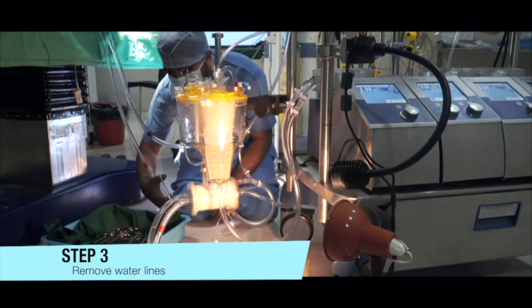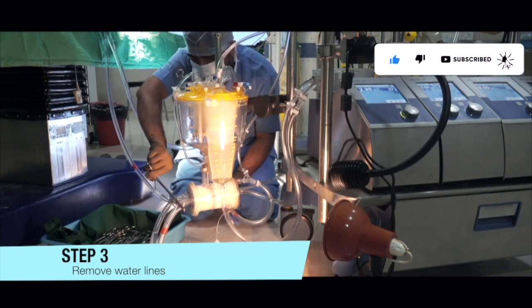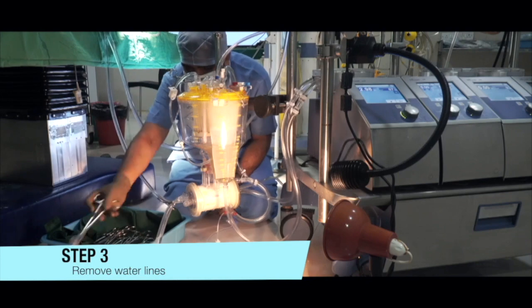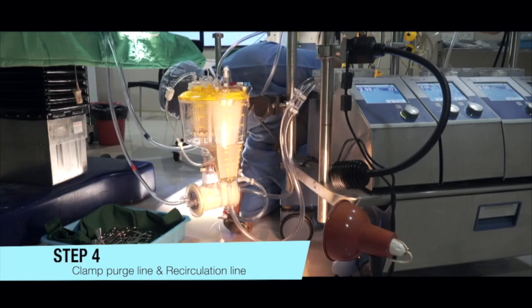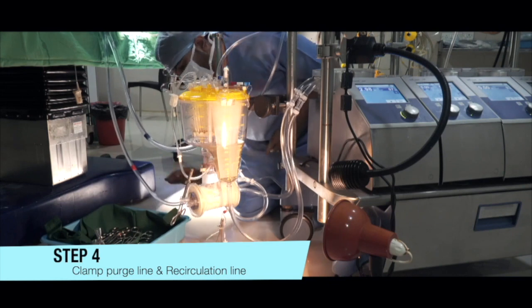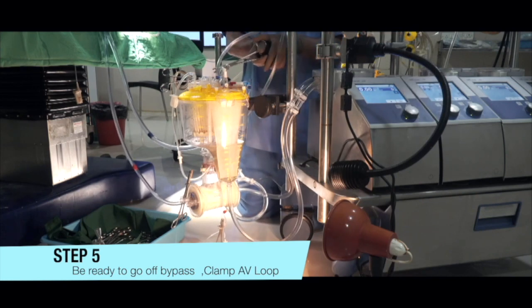Start this procedure by disconnecting the water lines, clamping both water lines. After disconnecting the water lines, clamp the purge line and recirculation line. Next step is be ready to go off bypass. After going off bypass, clamp the arterial line and venous line.